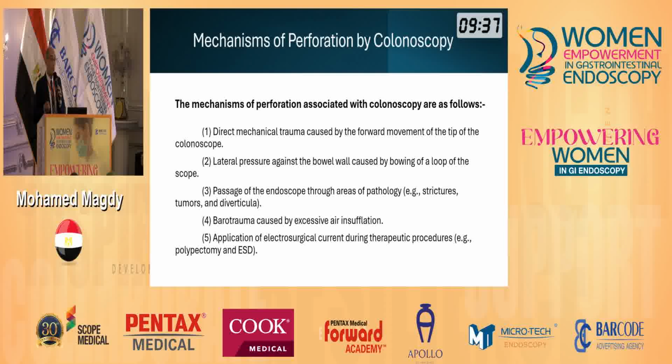Barotrauma, as we said before, is due to excessive air insufflation, and there is also the application of electrosurgical current, especially when we do polypectomy. Sometimes we use a high dose of electrosurgical current.